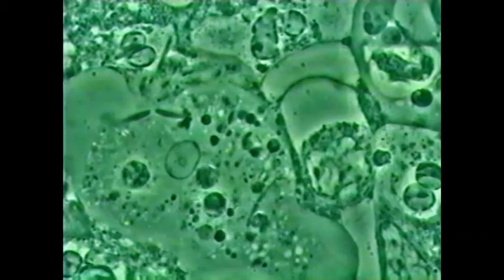This is why we think the microscope is very useful to explain to the patient, and also to complete the diagnostic of parasitosis during periodontal disease. Most active periodontal diseases are infections of bacteria, but most present is this amoeba, Entamoeba gingivalis again. Here again, one, two amoeba. We clearly can see the little nucleus, 4 micron, some ghost cells, again an amoeba, always surrounded by white cells.